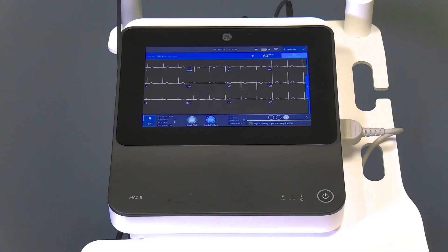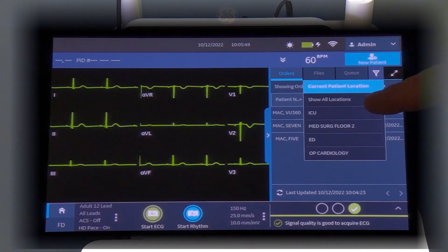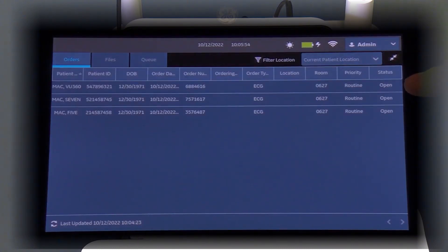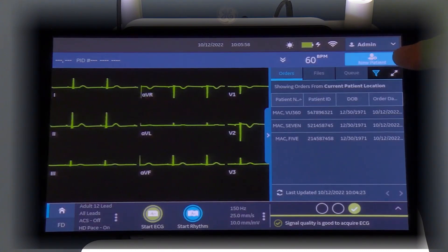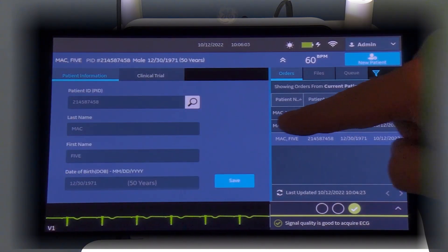There are several ways to begin a new patient test. Depending on your healthcare facility, the MAC-5 can support order ADT retrieval with or without patient barcode scanning. To start a new patient, simply scan the patient's barcode, or select the appropriate order from the order tab. The order interface is located on the right side of the screen. To filter the order locations, tap the filter icon. You can also expand this screen to view more order information. To select the order you wish to use, double tap the order. The order will then automatically populate the appropriate patient demographic fields.